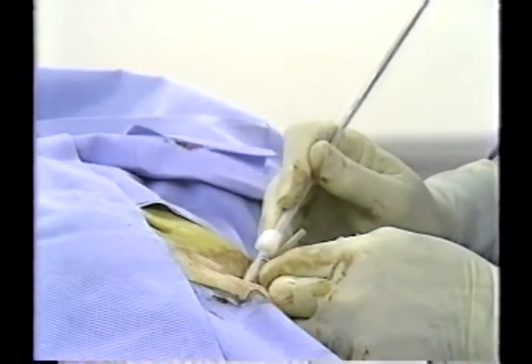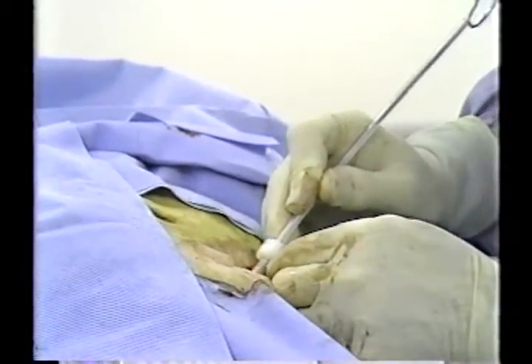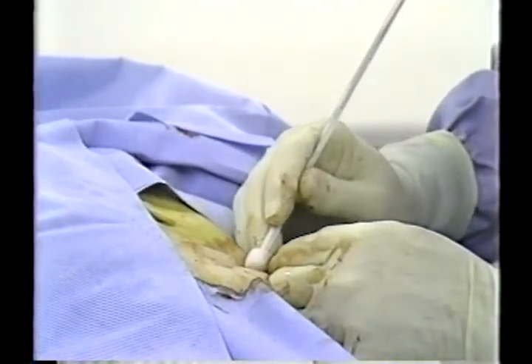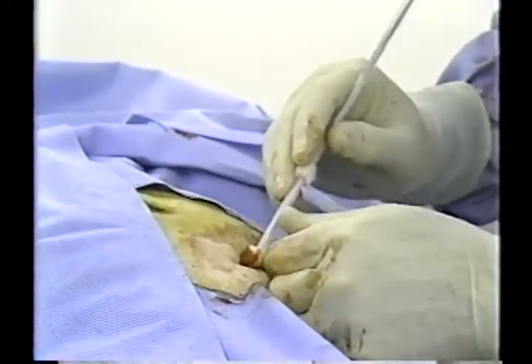The catheter continues to be advanced until firm resistance is met, indicating that the cuff has reached the anterior abdominal wall. This automatically ensures proper cuff location for the distal cuff.